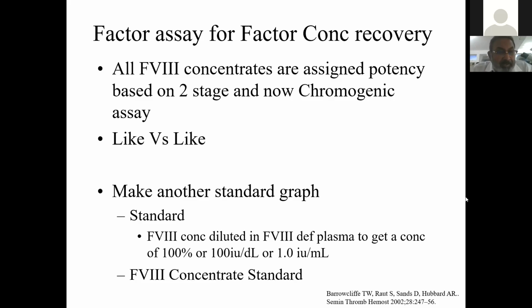Was the sample collected properly? If the sample is not collected properly, you will have a problem with this. Has the potency of the factor concentrate that has been given, is it within the expiry period? Because in many of our centers, we use factor concentrates which are beyond expiry. They work very well, no doubt about it. And if it's beyond the expiry period, has its potency been checked? So these questions have to be answered before you repeat another assay. Otherwise, you ask for a repeat sample, because you must realize an assay is as good as a sample. If the sample has been badly collected or has bad content, you're not likely to give a result that they expect, because these pre-analytical considerations have to be really considered.